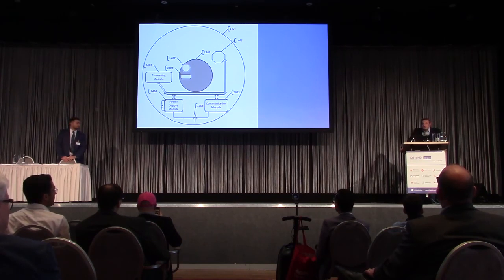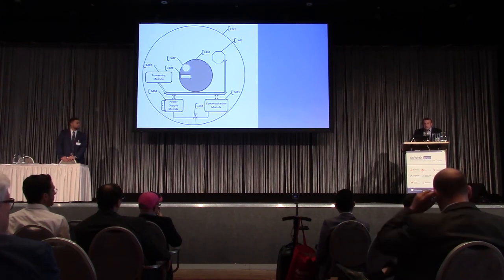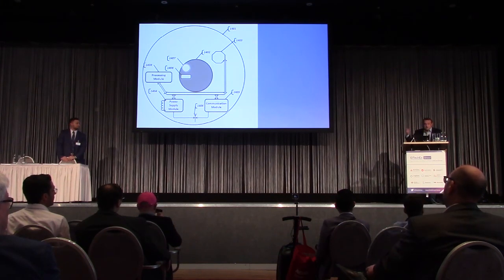If you asked me 3 years ago, I would have said that it's probably 15 to 20 years away, a functional contact lens like this. Now, given the level of miniaturization achievable, and the 3D printing that is happening, you can actually 3D print something like this, or close to this.